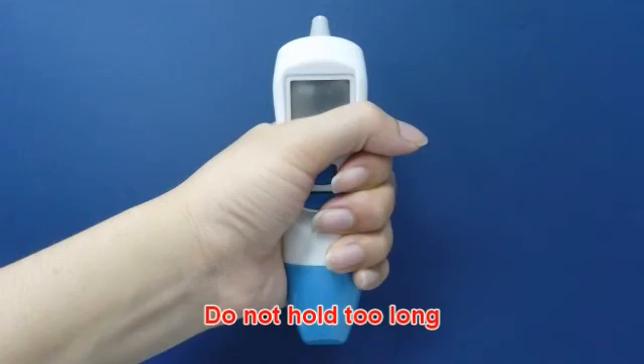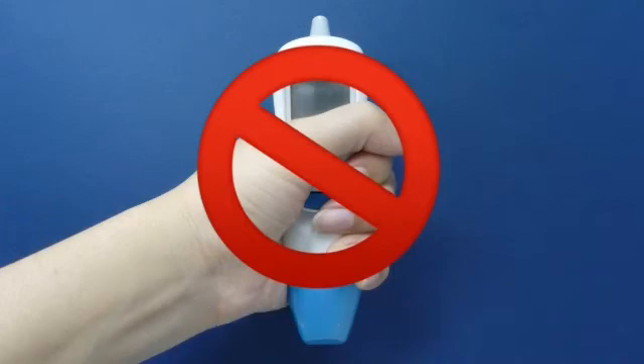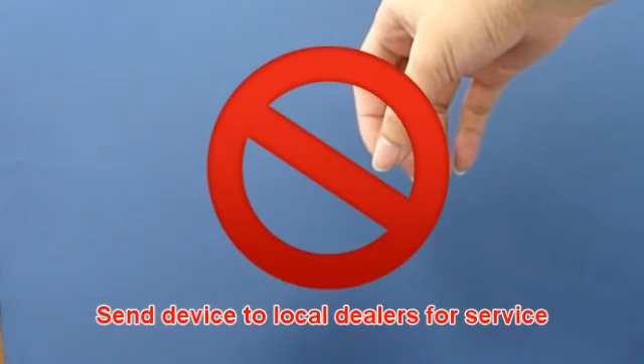Holding the thermometer too long may cause a higher ambient temperature reading of the probe, which could make the measurement lower than usual. Please check if the device is damaged if it falls. If you are unsure, send the device to your local dealer for service.